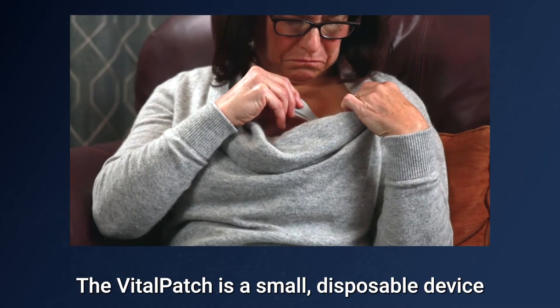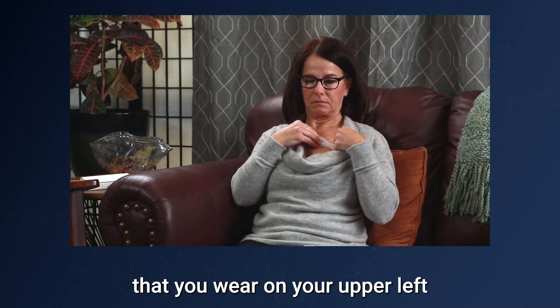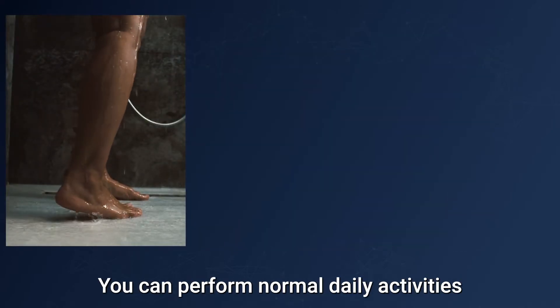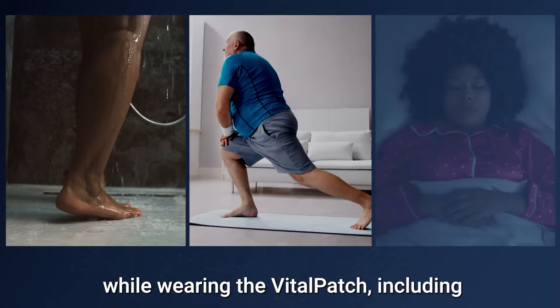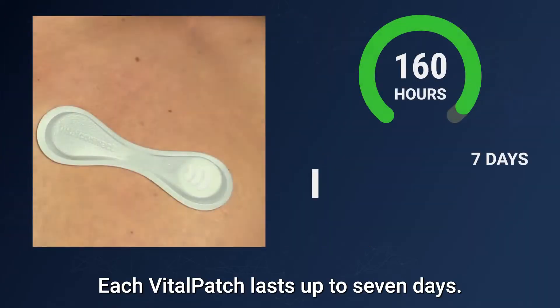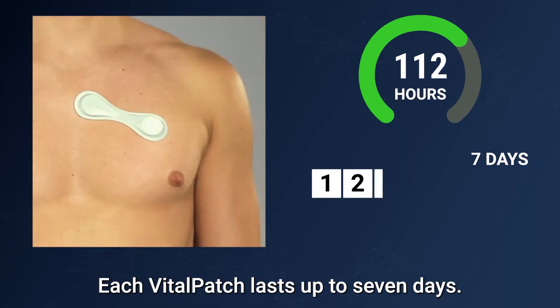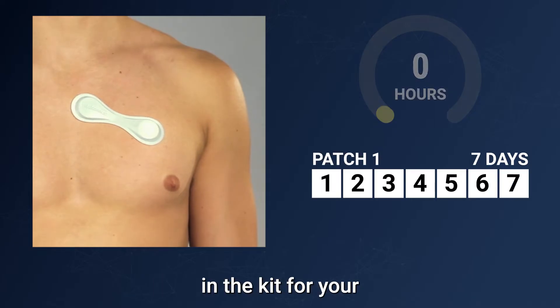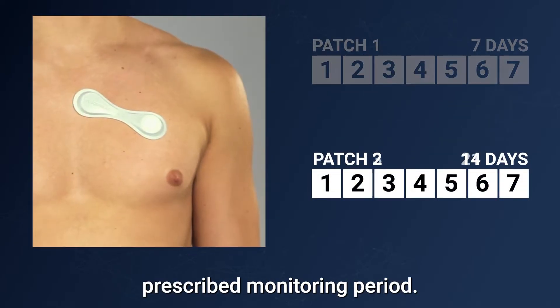The Vital Patch is a small disposable device that you wear on your upper left chest like an adhesive bandage. You can perform normal daily activities while wearing the Vital Patch, including showering, light exercise, and sleeping. Each Vital Patch lasts up to seven days. Your care provider will include the correct number of Vital Patch biosensors in the kit for your prescribed monitoring period.